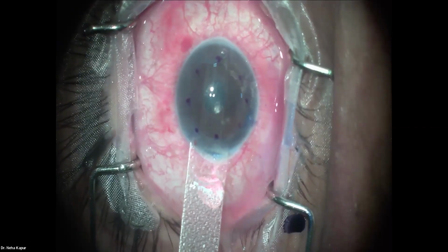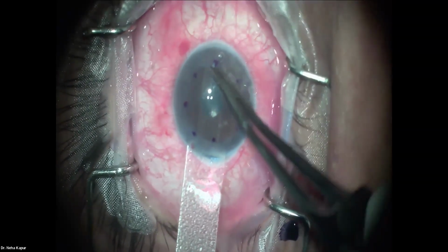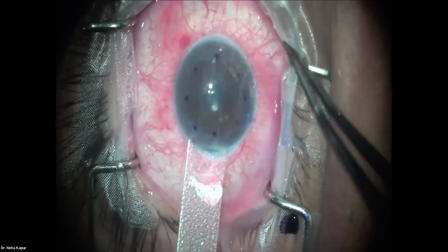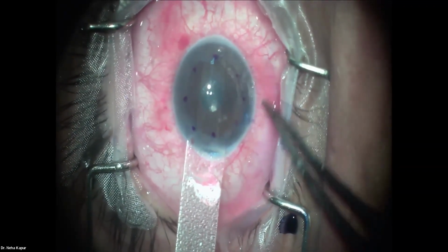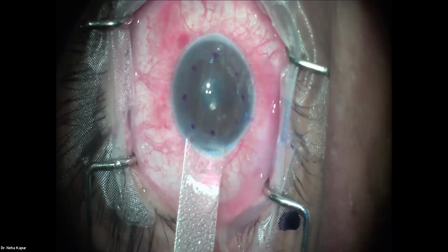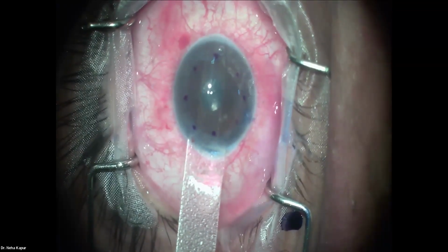Retina. So there is a little DM tag which is visible here. Ideally, it's good to get it out. However, it is a very friable small tag. Even if we were to let go, it would be fine. But if you're seeing it, you may as well get it out. You can take a microforceps and get it out. It's too far for the McPherson to reach.